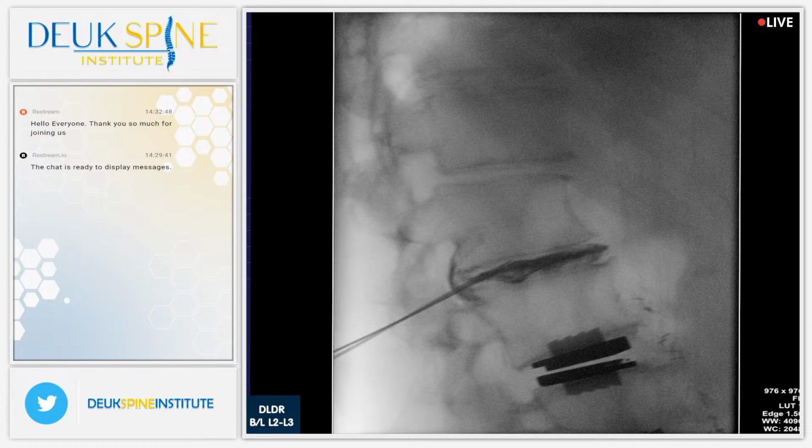Now this is a patient who was aware of his options and chose what he felt was the best treatment for him. And he continues to do that. I am a big proponent for laser endoscopic surgery. I'm totally against artificial discs because I know exactly what artificial discs are done to treat. They're used to treat herniated disc, bulging disc, degenerated disc, ruptured disc, extruded disc, protruded disc. Well, those are the same things the Deuk laser disc repair fixes. Let me know when I can proceed.